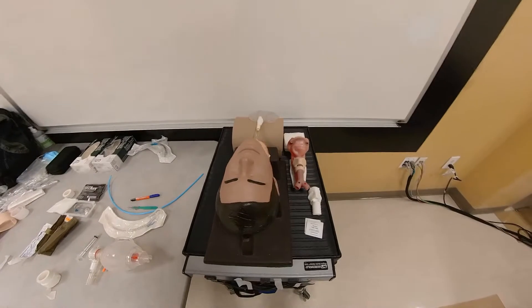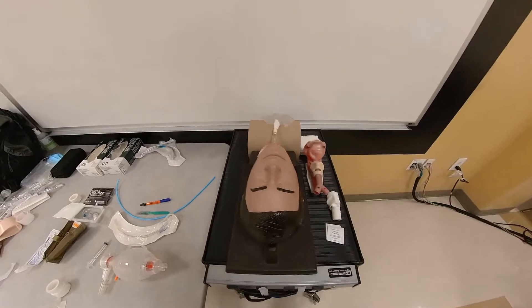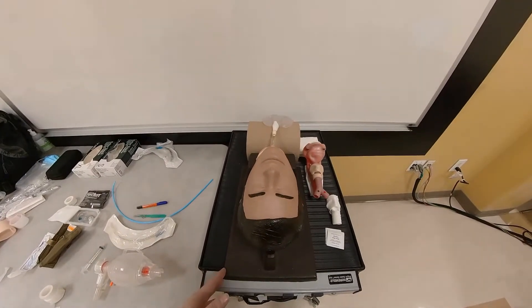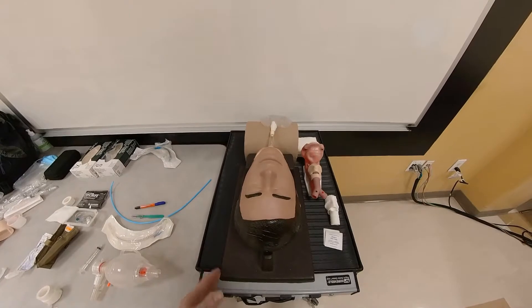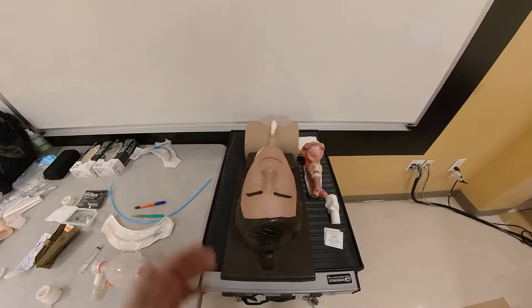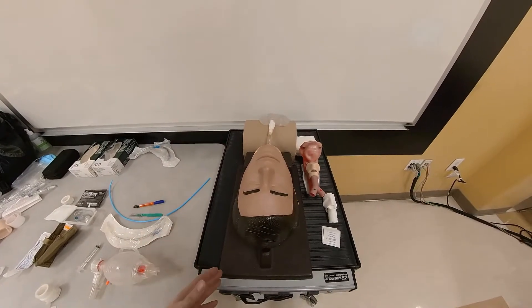Hello, my name is Nikolai Yusupov, and in this video I would like to show you surgical cricothyrotomy. So first, let's go over the indications of this procedure.